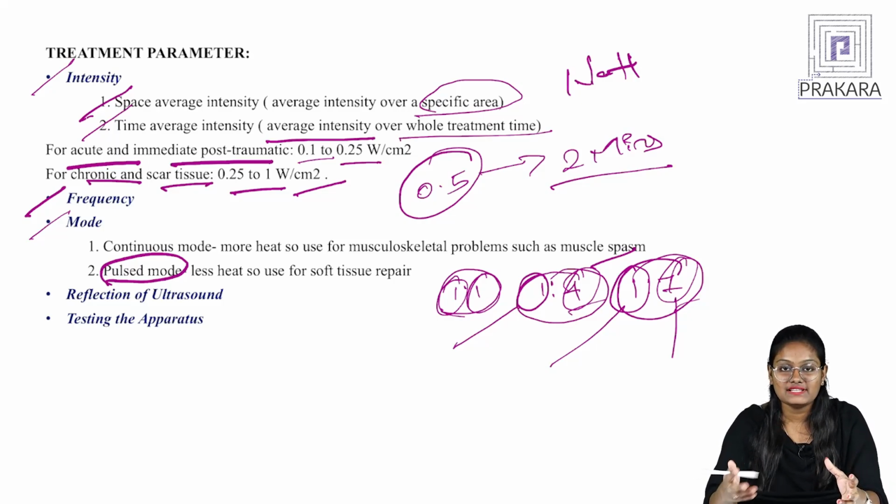Okay, so what actually happens in the continuous mode? Throughout the 2 minutes, this 0.5 intensity will pass into the patient's body.